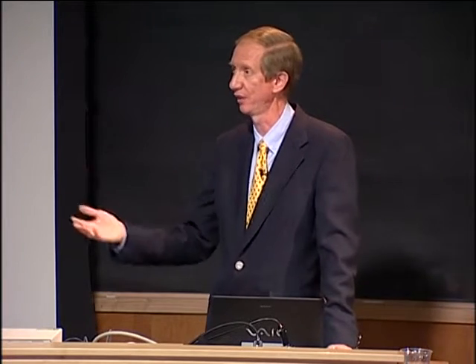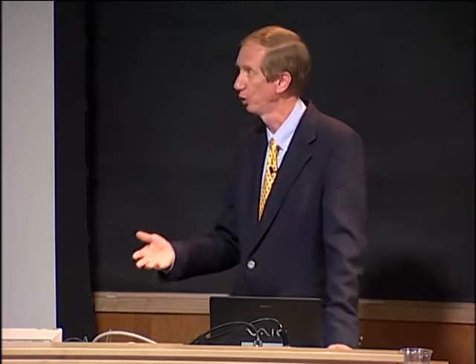45 minutes later, we get another emergency hemorrhage panel, and we see that, oh, this is one of the guys that is crashing. Could we do something that would predict which one is going to go into this acute coagulopathy and which one's doing okay? Or at least that they're not likely to go into that kind of problem.